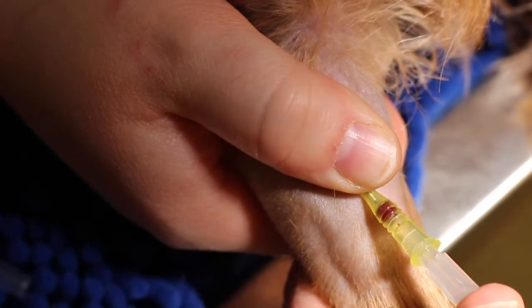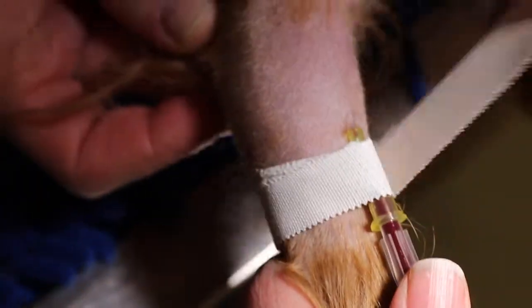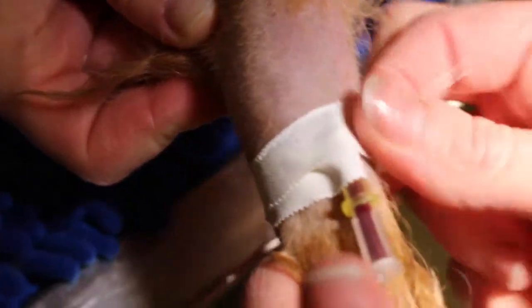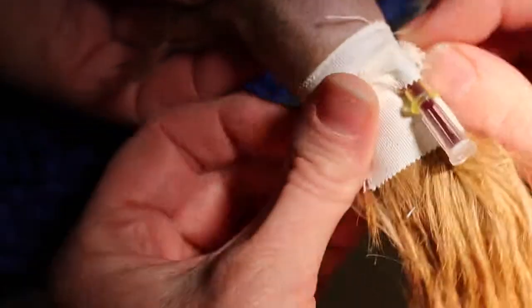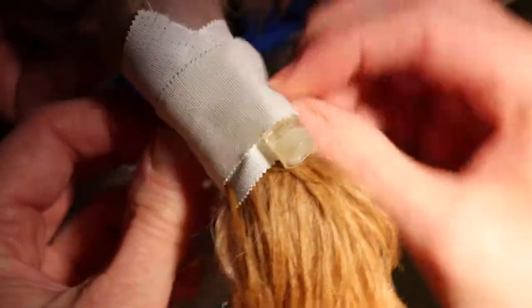This is a different taping method than you've seen in previous videos. I've torn a piece of tape in half, flipped it sticky side up, and slide it under the catheter. Then I fold the sticky side down on itself and tape it around the arm — that's the piece that holds my catheter in. I take my next big piece of tape, make a small tear in the end, and feed it up under the catheter to protect from fur getting in. Then I tape around the catheter again for extra protection. Now you can see where my cap is going to go — there's no fur under there. So I take my temporary cap off and put my injection cap on, then put one more piece of tape around that cap to secure it.